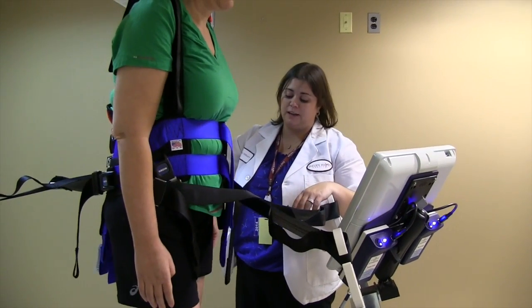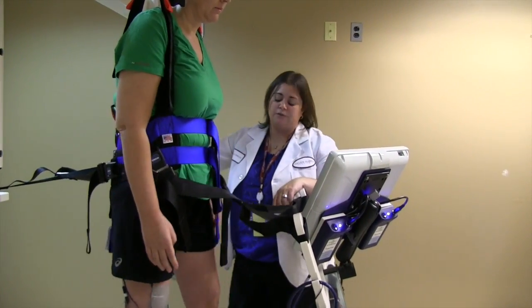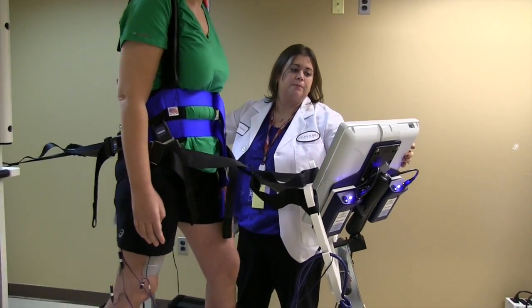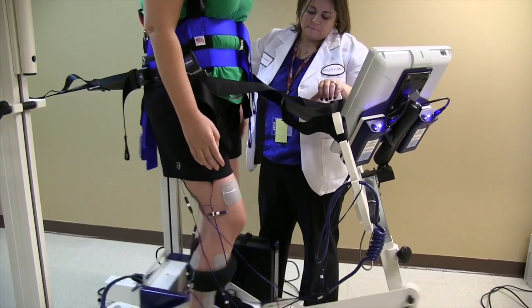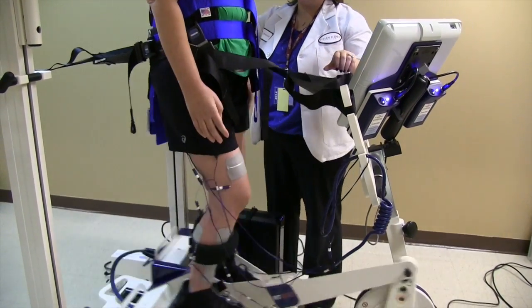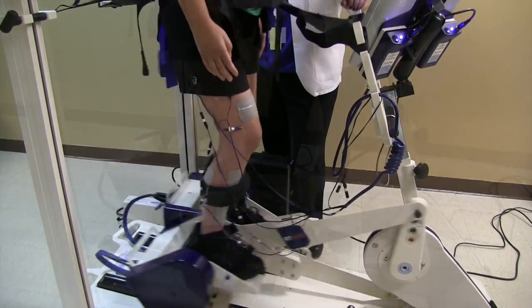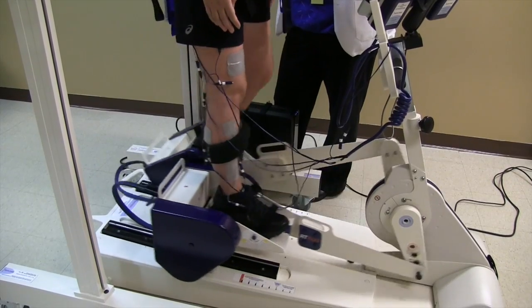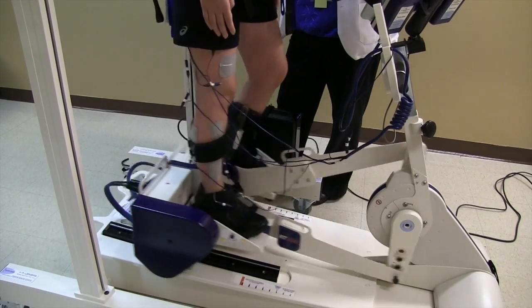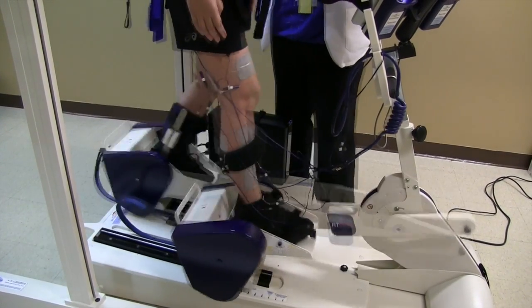I want you to make sure on your left leg, when your leg is right underneath you, you want to have your knee fully extended. In a couple of seconds you're going to start to feel the stim turn up. Your stimulation levels have all been set to what you tolerate the most and where you get the best contraction.